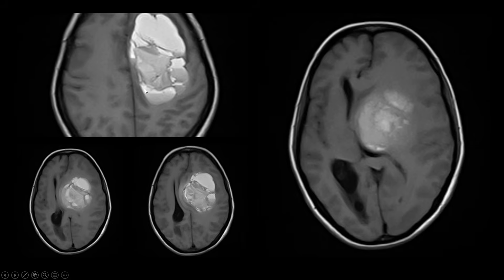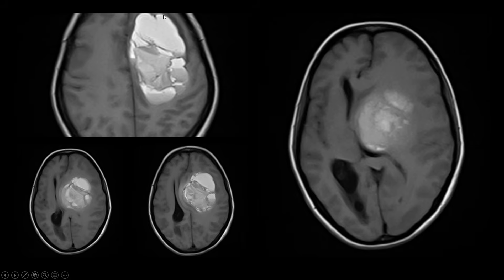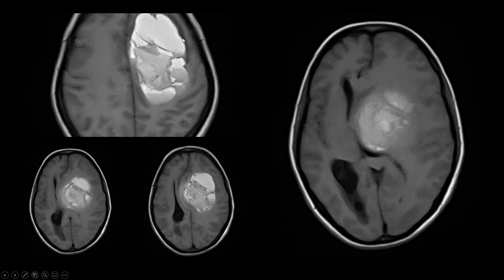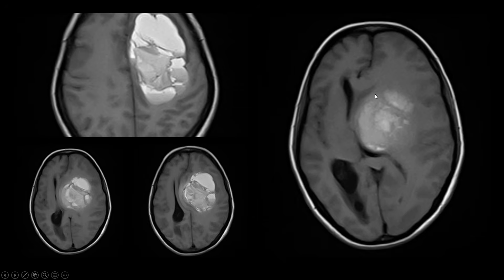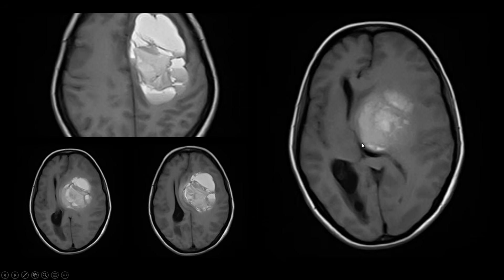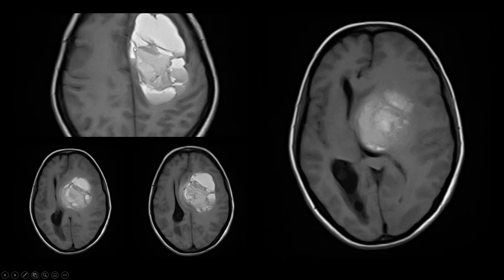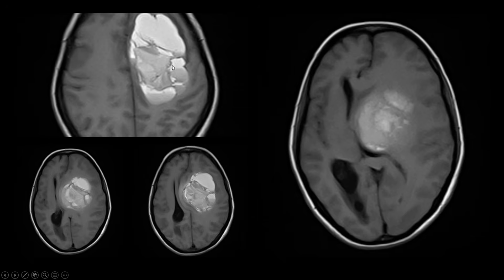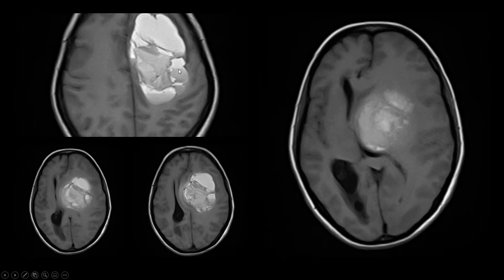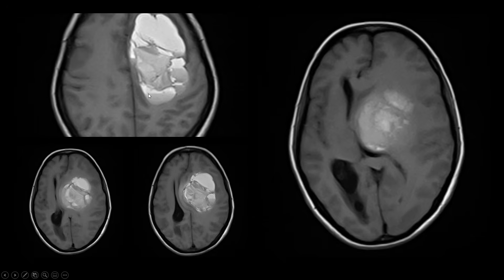These are the T1 axial weighted images. You can see a lobulated heterogeneously hyperintense signal lesion noted in the left frontal lobe, partly extending into the left capsular ganglionic region, with significant mass effect and midline shift. This is the central iso to hyperintense component. These are the septations and these are the fluid-fluid levels of variable signal.